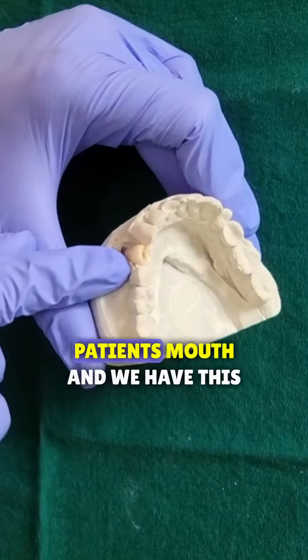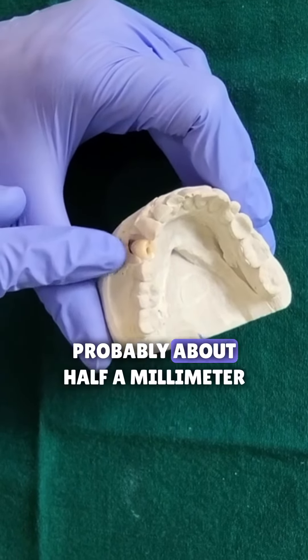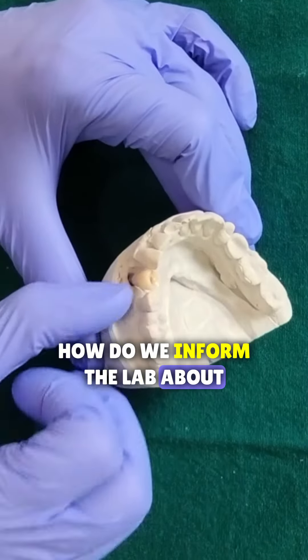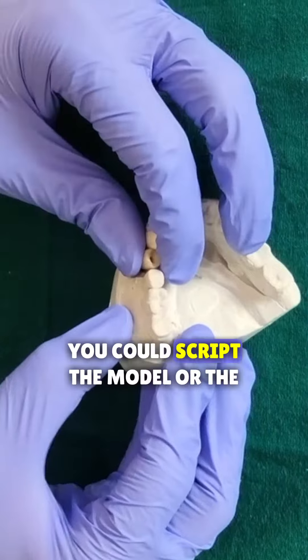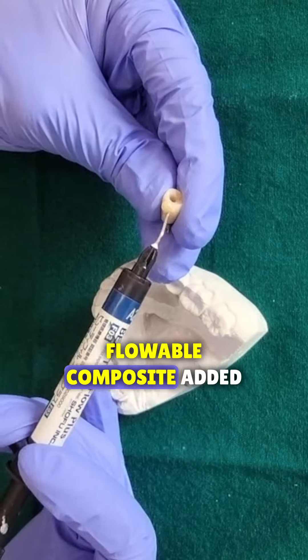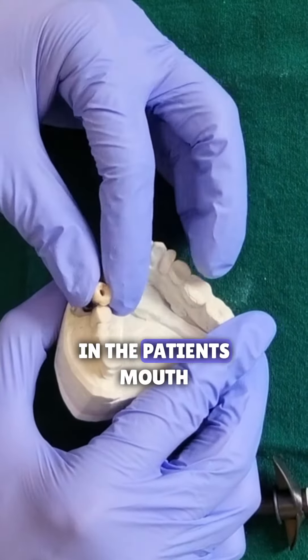So let's imagine that this is the patient's mouth and we have this much of an open contact, probably about half a millimeter on the distal. How do we inform the lab about this open contact? Well, I already showed you in the previous video — you could scrape the model — or the other option is to use some flowable composite, add it over there and then seat it back in the patient's mouth.